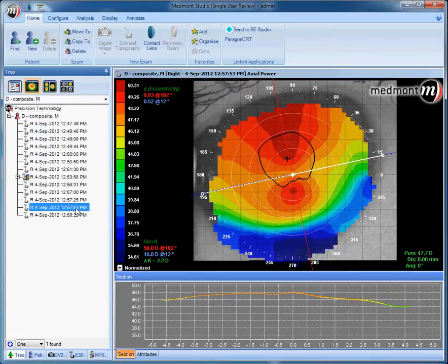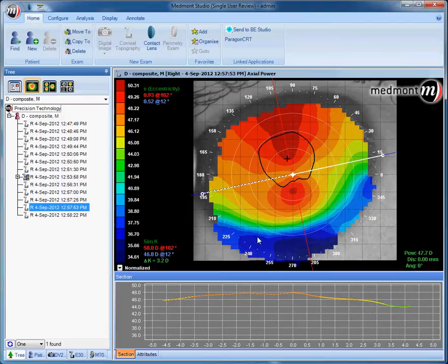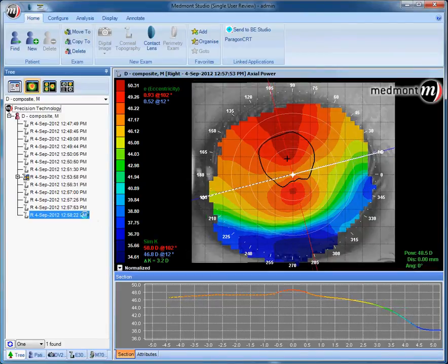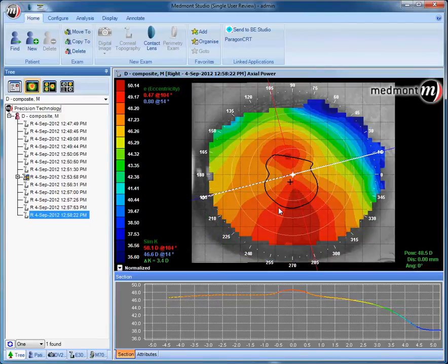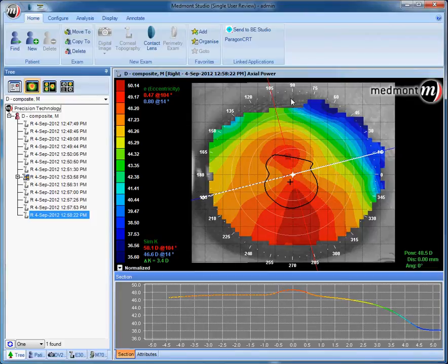The next image is having the patient looking three to five rings superior, pushing the placido reflection inferior. Last image, having the patient looking inferior, pulling the lid back, and pushing the placido reflection superior. Once you have the five images or more, you can take images on the eight principal axes of the eye.